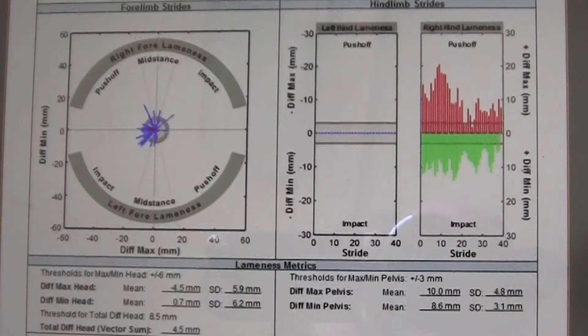The horse in the video shows a very clear right hind limb lameness. Looking at the Lameness Locator report, the left side of the screen shows the front limbs — each blue line represents a single stride, and in a perfectly sound horse all lines would cluster around the middle, as they nearly do here. For the front limbs, any number over six represents lameness; this horse shows minus 4.5 and 0.7, consistent with a symmetrical forelimb gait — sound in the front limbs.